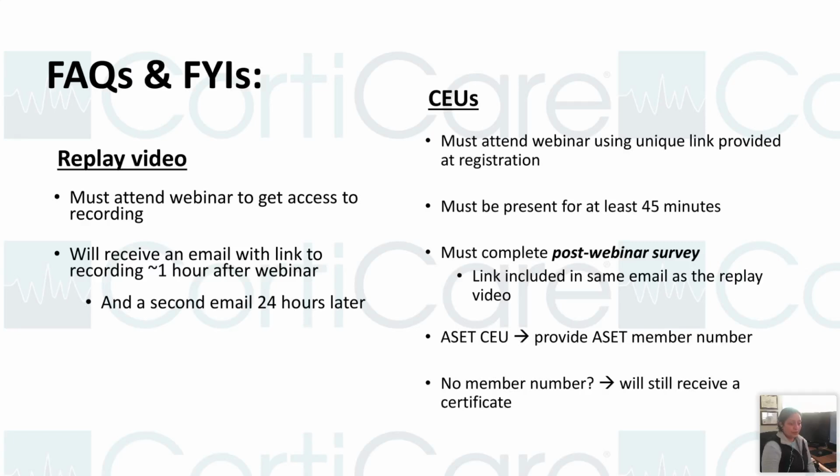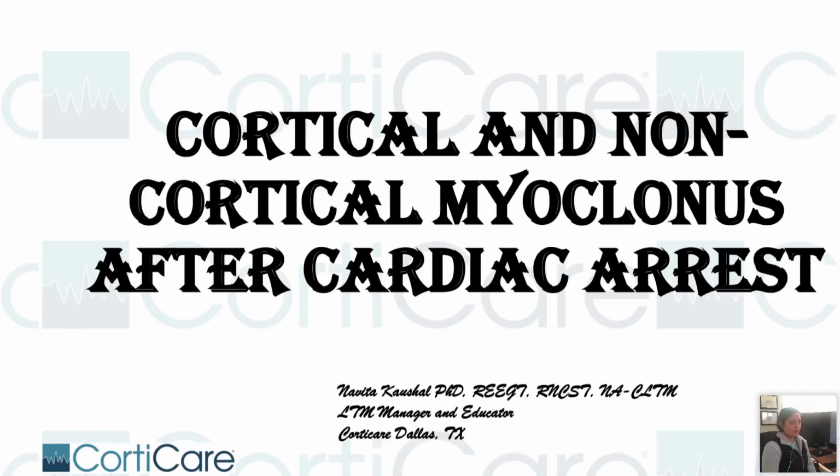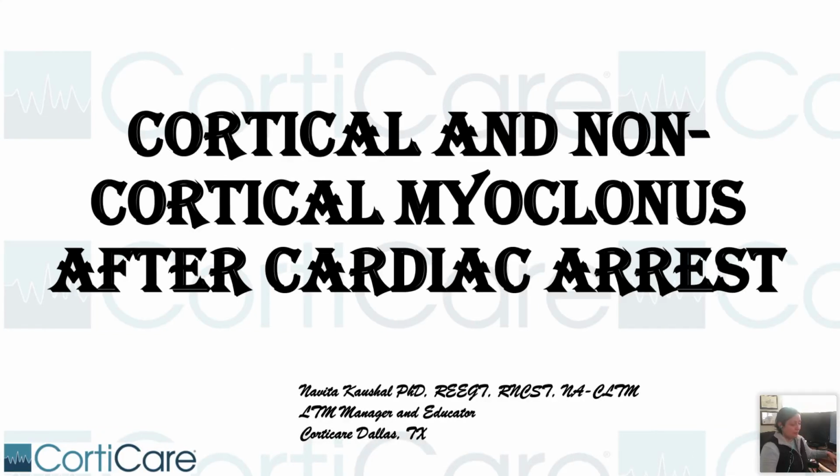Thanks, Brad. Okay, we'll get started. This is another controversial topic among all the EEG techs out there: after cardiac arrest, the myoclonus that we are seeing, whether it is cortical or not cortical. So I'm going to cover not just the myoclonus, but the events associated with cardiac arrest, what leads to the myoclonus, and how the EEG changes.